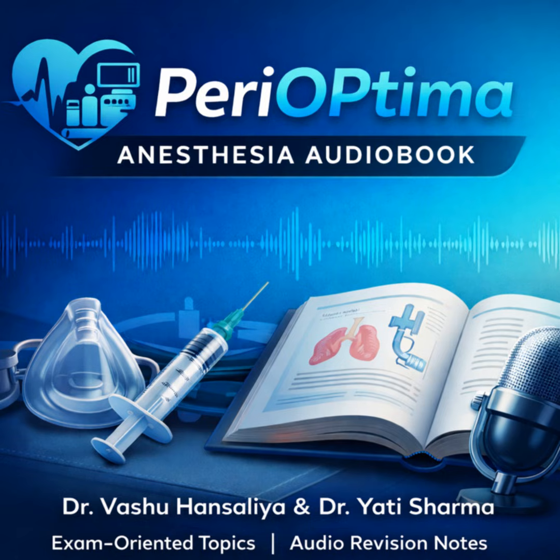6. CL grades IIB and 3 mark the start of significant intubation difficulty. 7. VLs are classified by channels, like Airtraq, or angulation, like Glidescope. 8. VL is preferred for C-spine immobilization because it reduces neck movement. 9. A key limitation of VL can be a longer time to actually pass the tube, increasing patient stress. 10. Dental trauma is the single most common mechanical complication of DL. 11. Hyperangulated VLs require a pre-shaped hockey stick stylet to prevent mucosal trauma. And 12. The definitive gold standard for confirming ETT placement is always capnography.